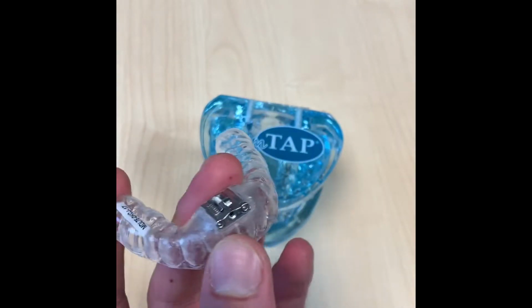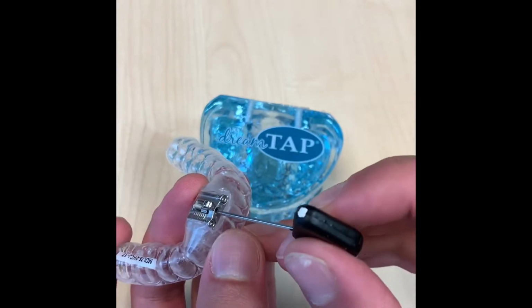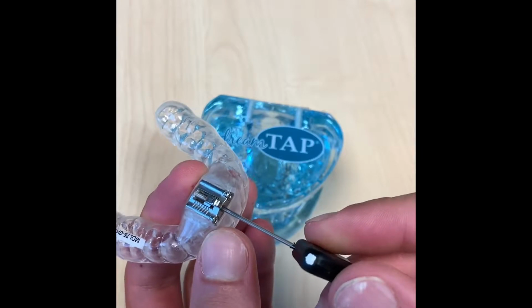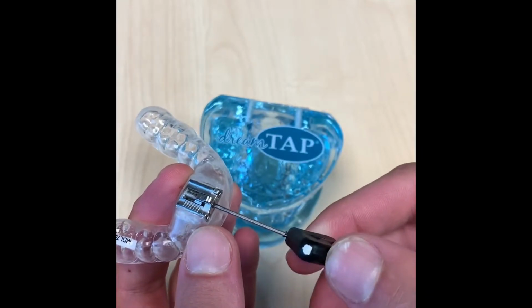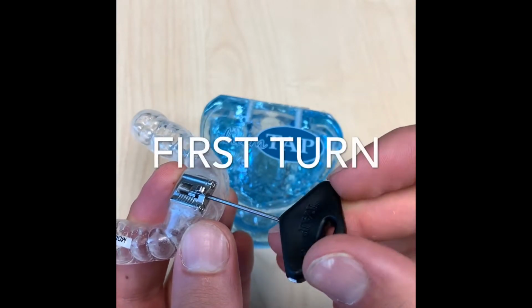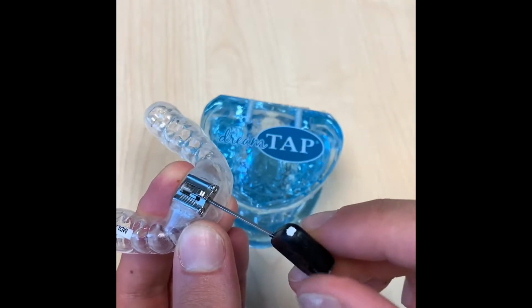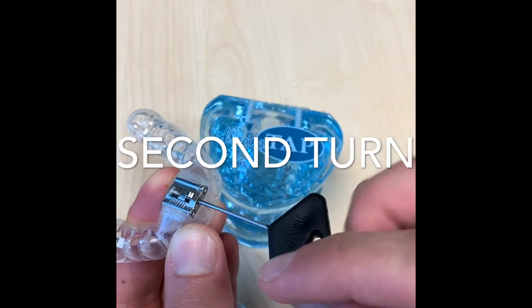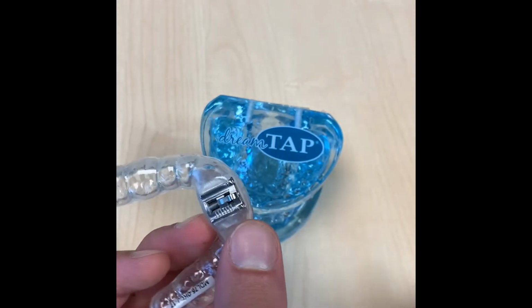So to make the adjustment, you simply insert the key into the little keyhole here in the front, and we'll make 2 full turns counterclockwise. You can see we've got a little white dot noted here to help us denote 1 full turn. So after making the 2 full turns counterclockwise, we've advanced 1 millimeter.